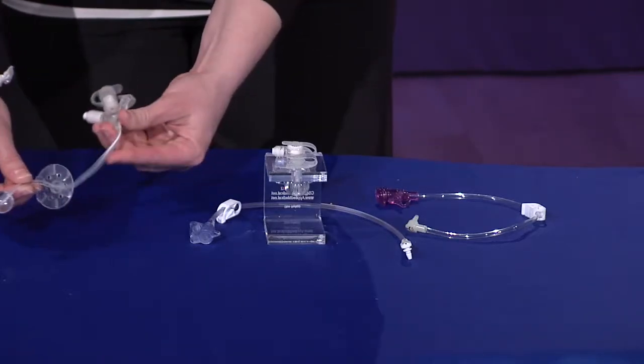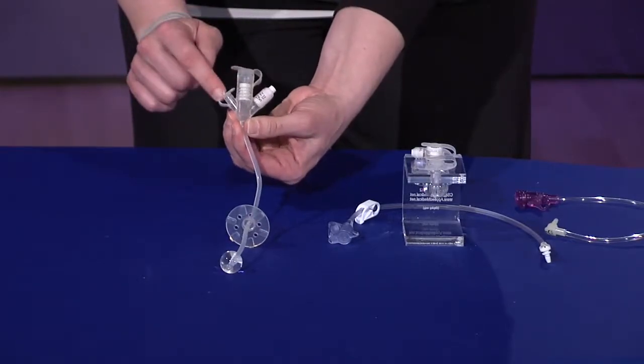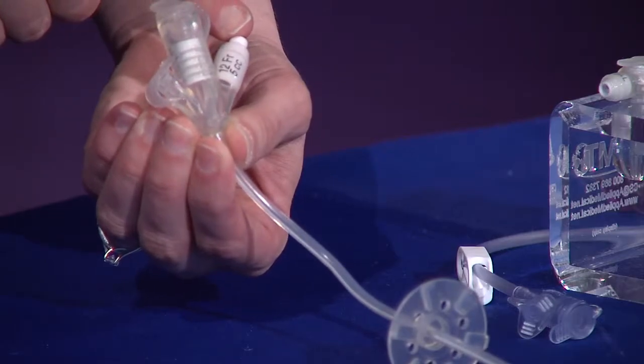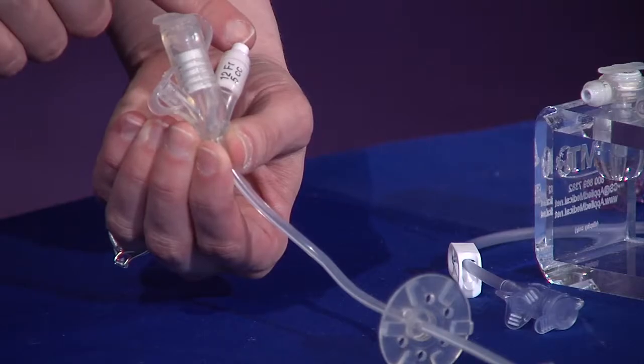There are 3 ports or openings at the end of the tube: a small medication port, a larger feeding port, and a white balloon port. The balloon port should not be accessed unless instructed by your healthcare provider.